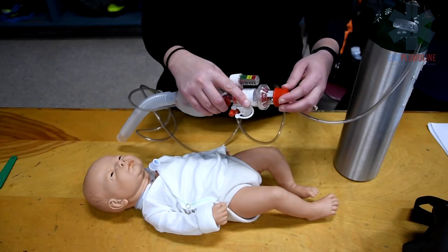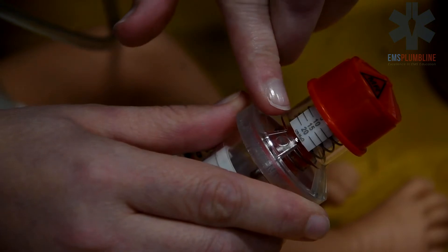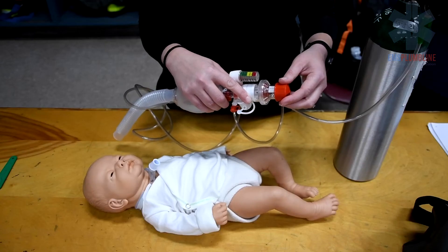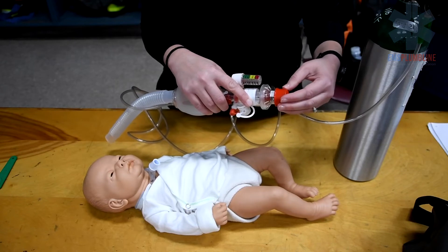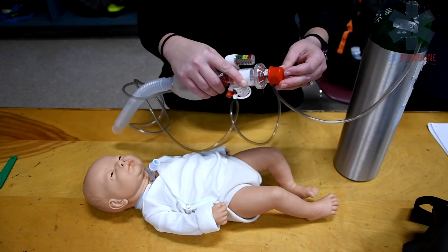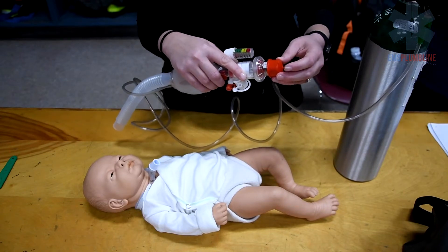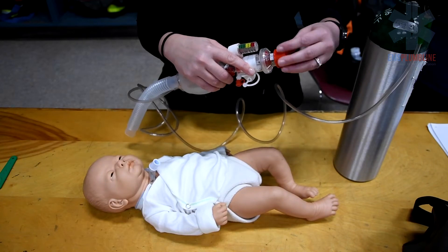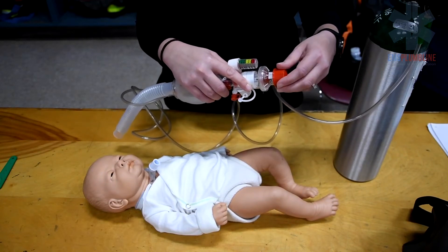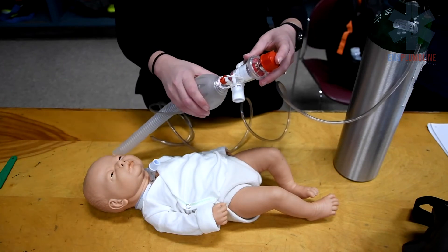The PEEP valve is at the top of the Ambu bag — red on our bag here. PEEP means positive end expiratory pressure, which equals the amount of air left in the lungs after exhalation. When there is zero PEEP, the lungs will collapse. Normal PEEP is around 5, though some children require a higher PEEP to keep their lungs open. If a child is on a ventilator, the PEEP setting of the Ambu bag should match the PEEP setting of the ventilator.